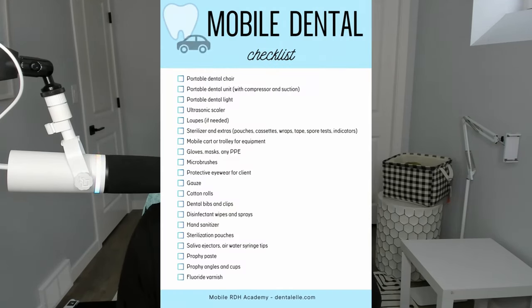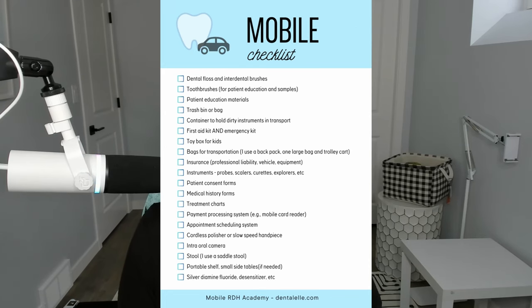Let's talk about a checklist of things you're going to need as a mobile dental hygienist. Now I say need, but of course this is different for everybody. I will go through a couple items where I'm going to say, well, this would be nice to have, but do you really need it? It's not just a want, but it could be a need — this will help to get you started.